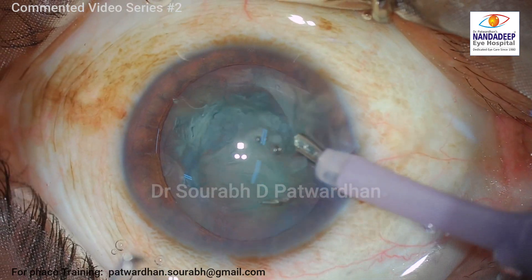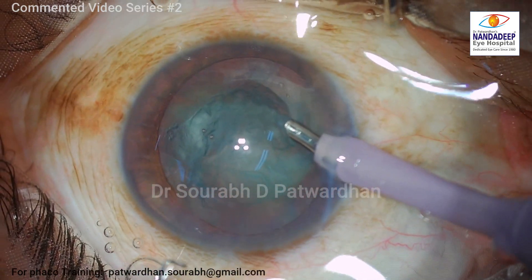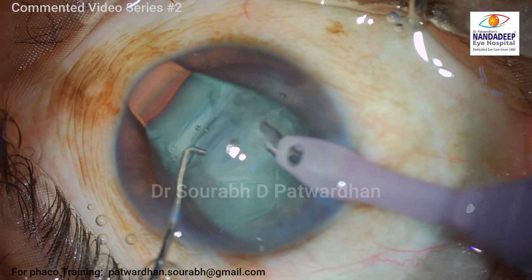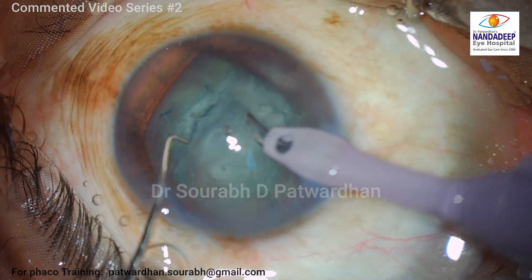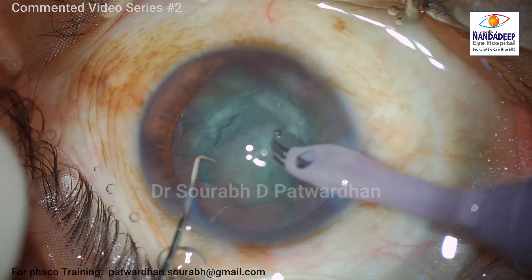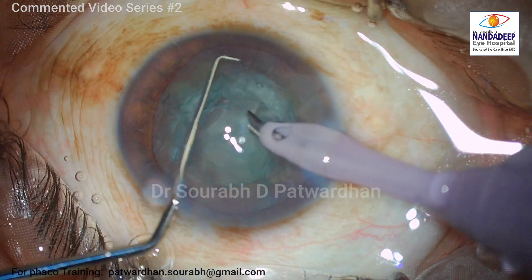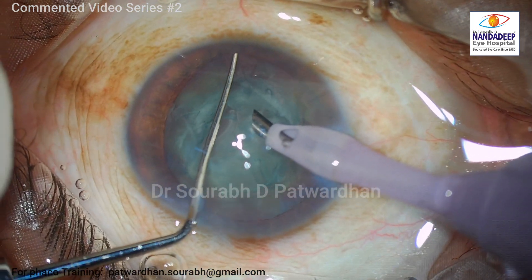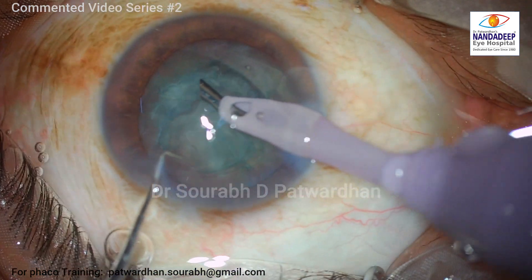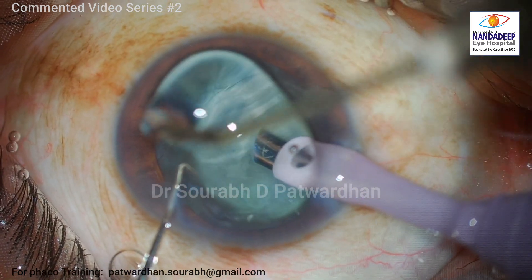You can do the rotation after you insert your FACO probe also, but in this case I decided to do it before. When I inserted the FACO probe, as soon as the irrigation started, the patient had a little bit of discomfort — that was because of LIDRS, the lens-iris diaphragm retropulsion syndrome. As you can see here, I lifted the iris to break that reverse pupillary block, which was causing the pressure to rise.